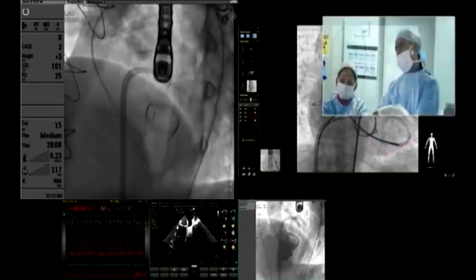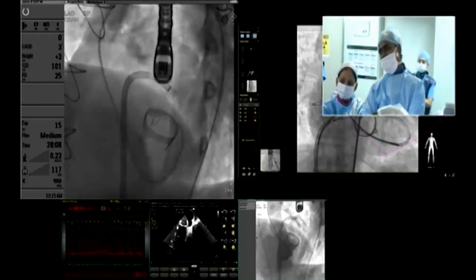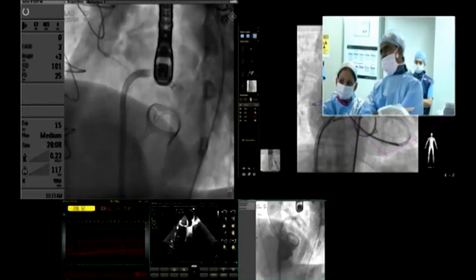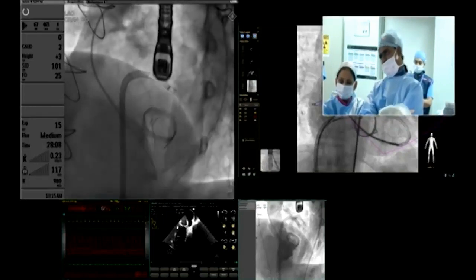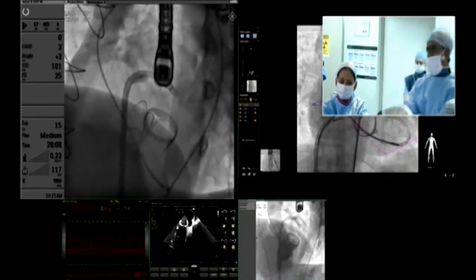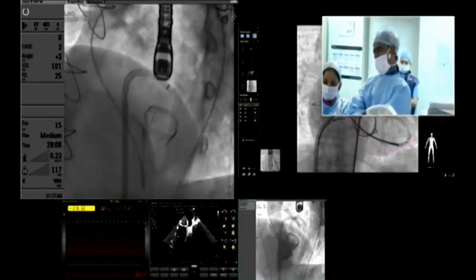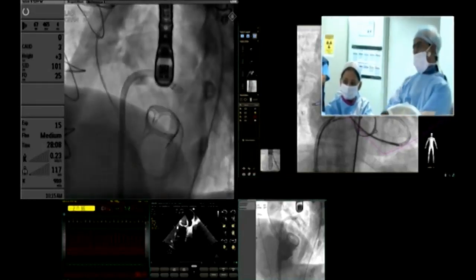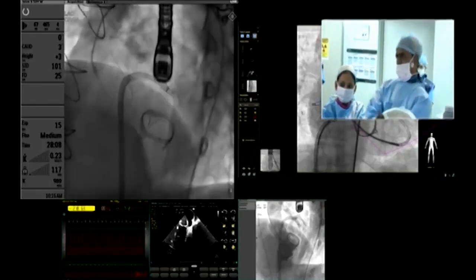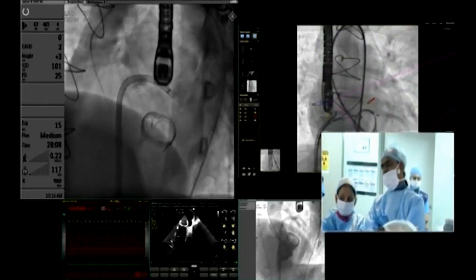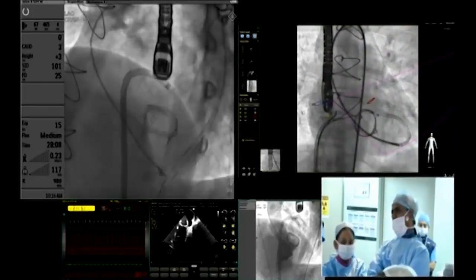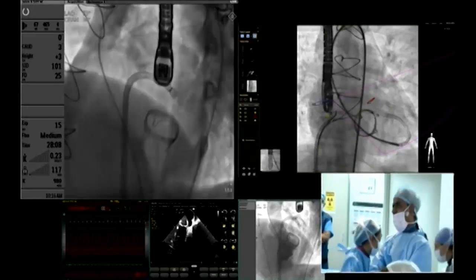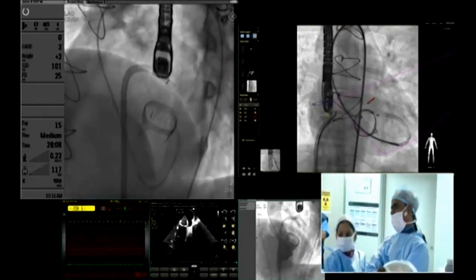I totally agree — for most paravalvular leaks on the mitral side it is always easy to cross from the left ventricular side. A lateral PVL is still relatively easier to cross than a medial one. Now this is the Judkins Left catheter walking in, and by the time we put the Judkins Left into the left ventricular recess, the guidewire automatically walks through the paravalvular leak. You can see the paravalvular leak being crossed by the straight Thermo guidewire.